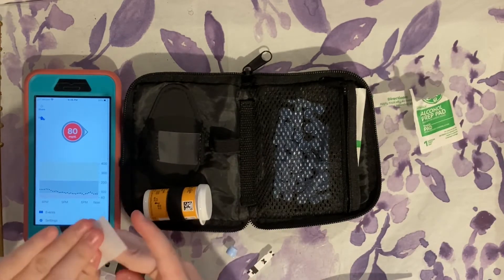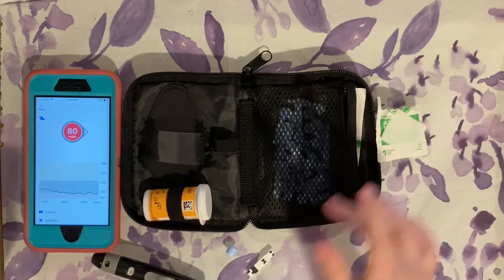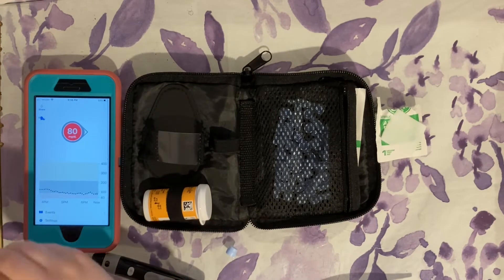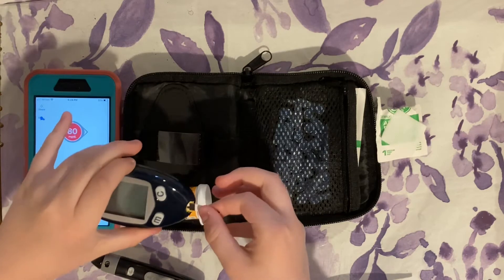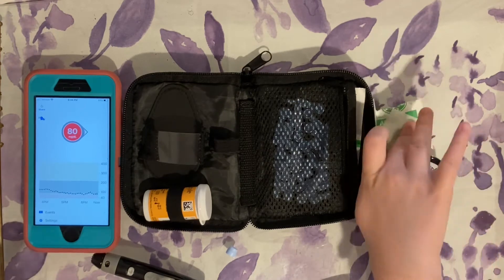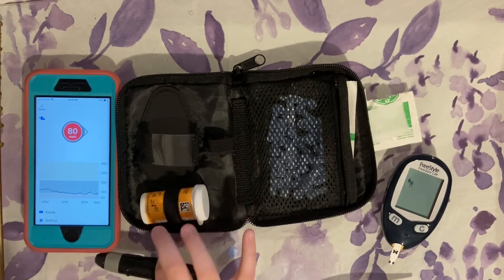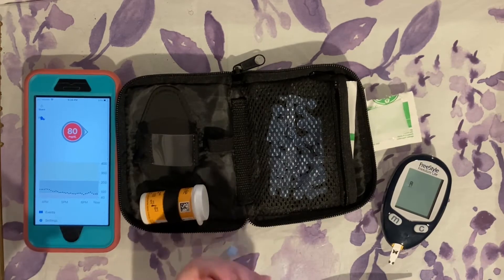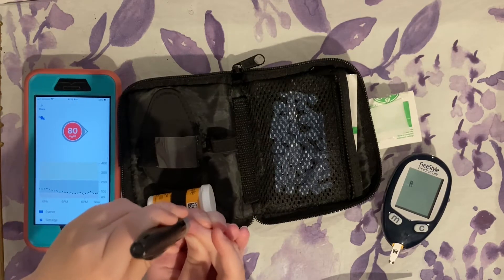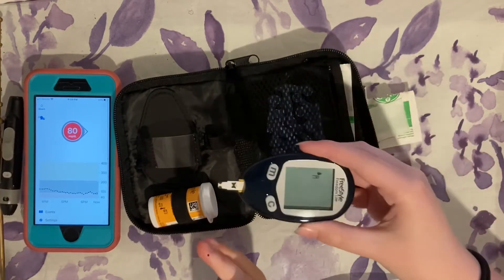I'm going to do my right middle finger. Just set the alcohol swab aside and put your test strip in your glucometer — it automatically turns on. I'm going to re-clean my finger just to be safe, and now I'm going to have my sister pinch my finger. Then press the little button to lance it — that's definitely enough blood.